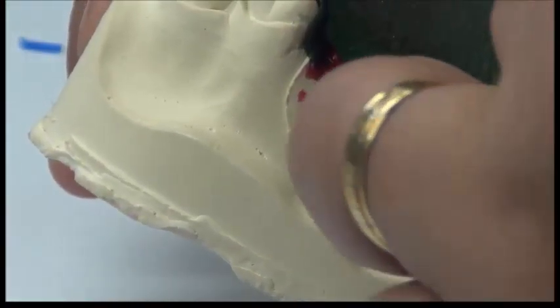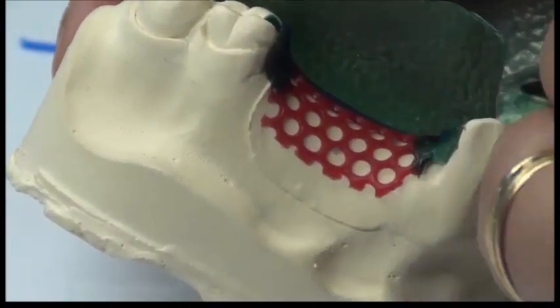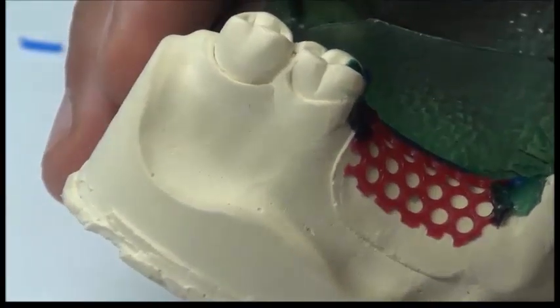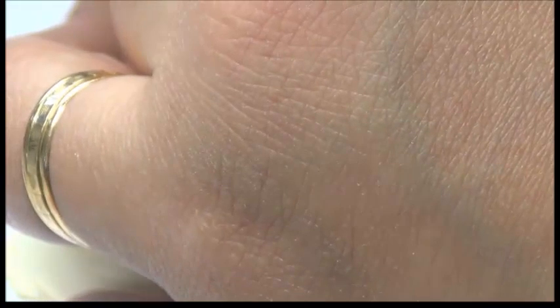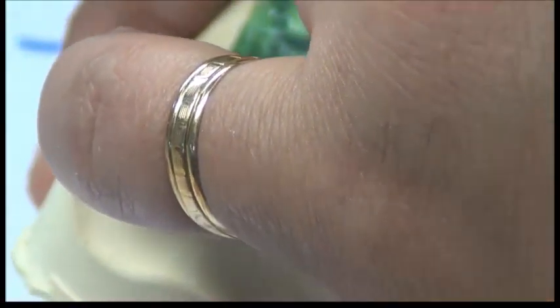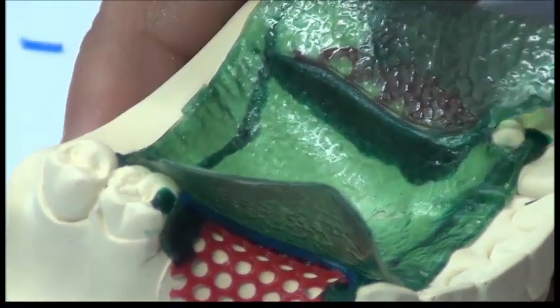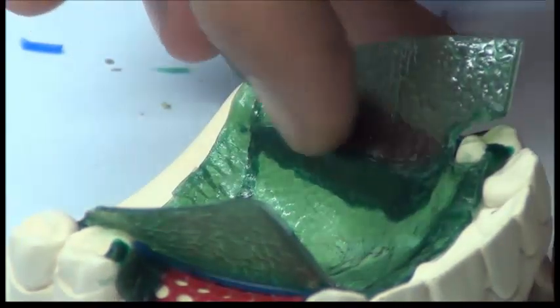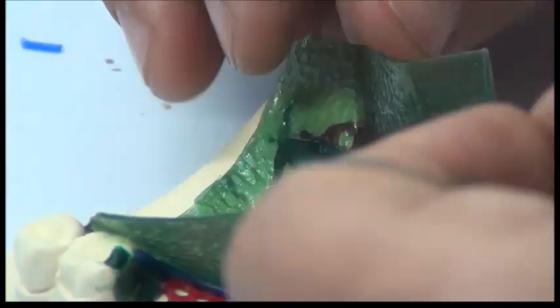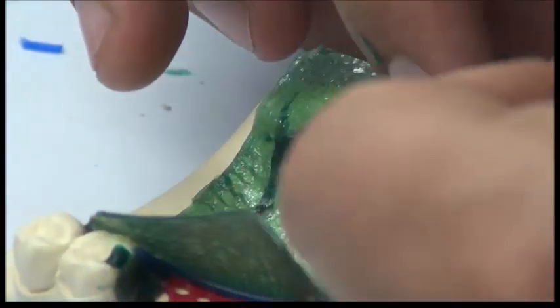So if I'm cutting a plate, I'm going over the palatal surface of the cusp, over the survey line. I'm reaching the survey line, not more. Then I'm reaching now the external finish line. When I cut on the external finish line, simply I cut vertically, using my step on the finish line as my guide. So I have used the finish line itself as a guide where I place my knife. So my knife is vertical on the finish line. Okay? And I try to separate the two pieces from each other.